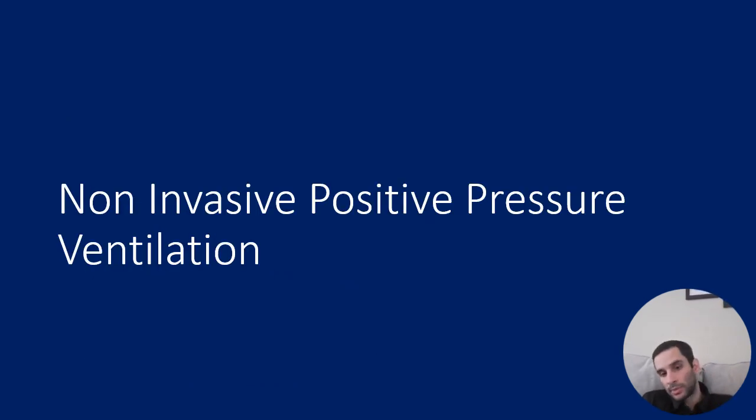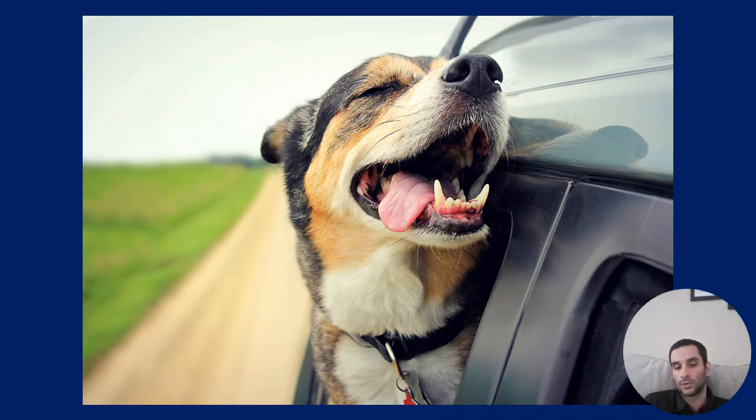Now, let's talk a little bit about non-invasive positive pressure ventilation. So, what is that? That's CPAP, that's BiPAP. I want you to imagine, when you stick your head out the window and the air blows in your face, that's essentially what that is. That's essentially that machine just blowing air continuously in your face.